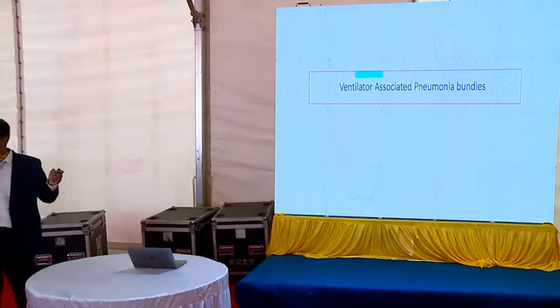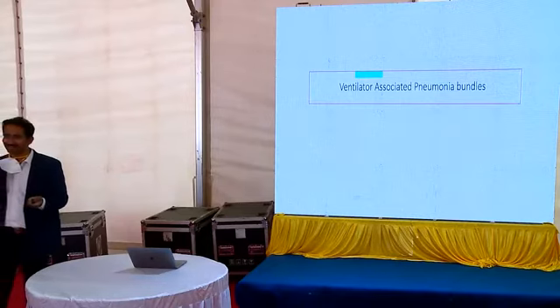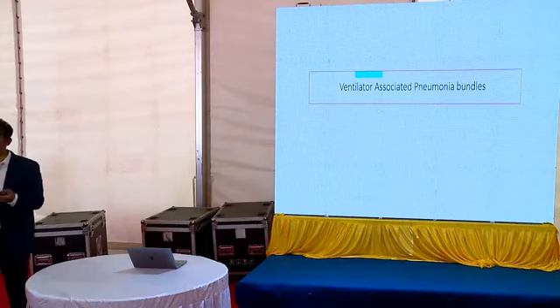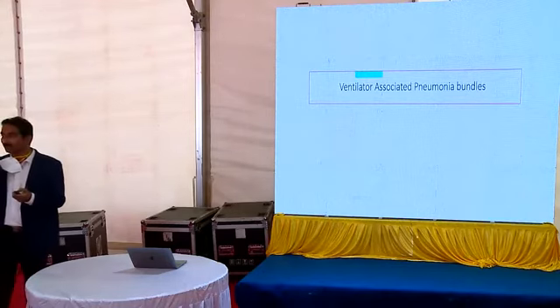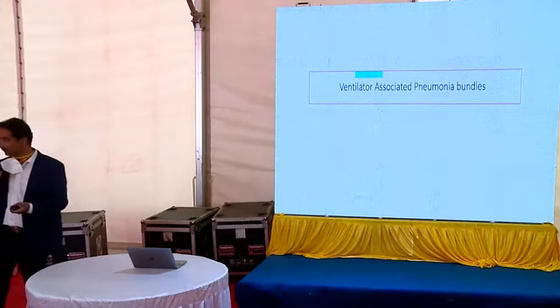There are a lot of VAP bundles, but you know what is the best way to prevent VAP? Not to ventilate, or to extubate them as soon as possible. So non-invasive ventilation has taken a big way. Many of these babies are now being managed on CPAP, and to some extent on NIPPV also.